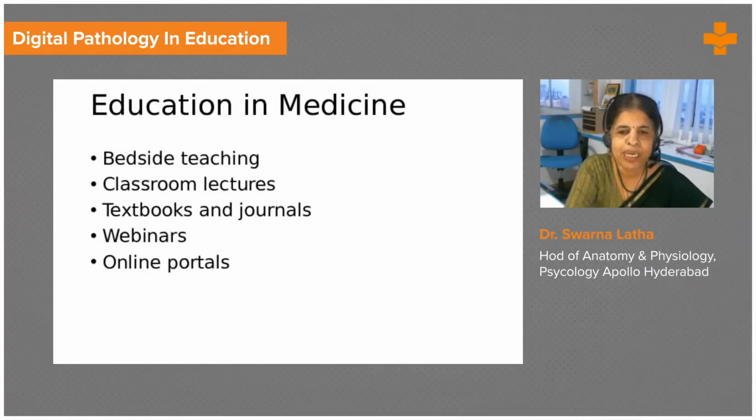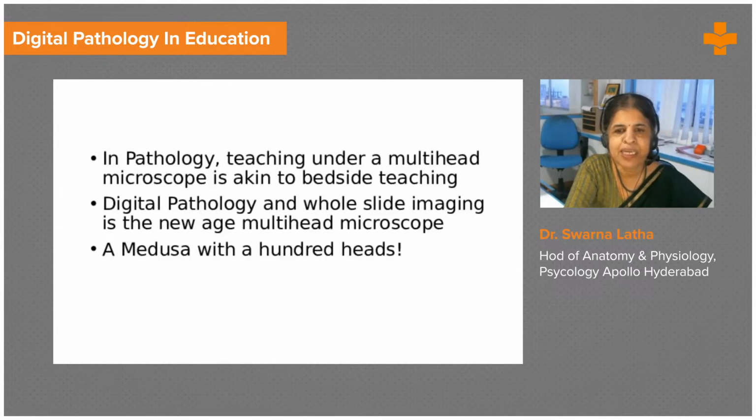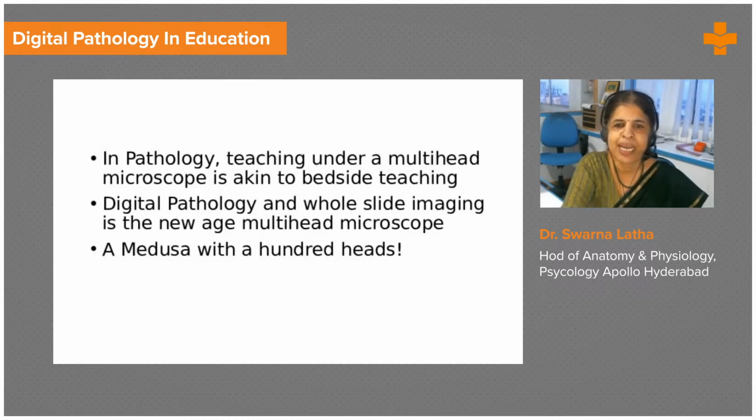The reason I'm talking about bedside teaching is that teaching under a multi-head microscope is akin to bedside teaching for pathology, where the teacher actually navigates the slide along with the student under the microscope and teaches them cell by cell. That is a great learning experience for students of pathology. And digital pathology and whole slide imaging is nothing but a new age multi-head microscope. You could say like a Medusa, a microscope with 100 heads.